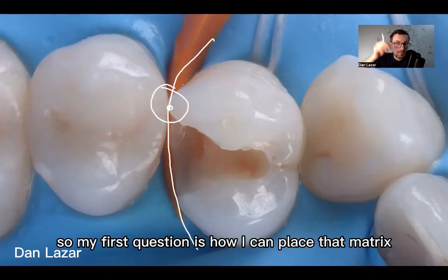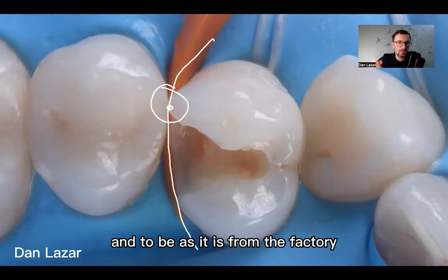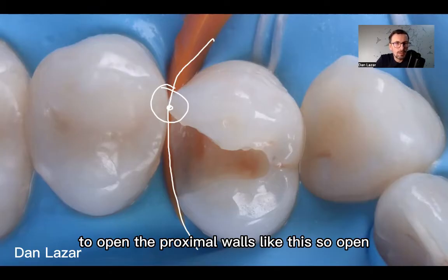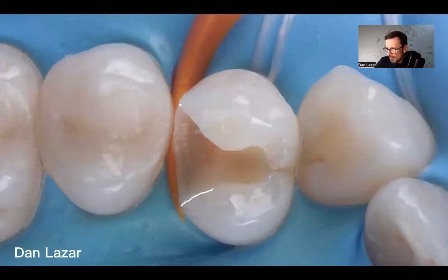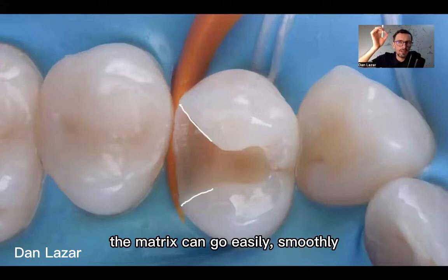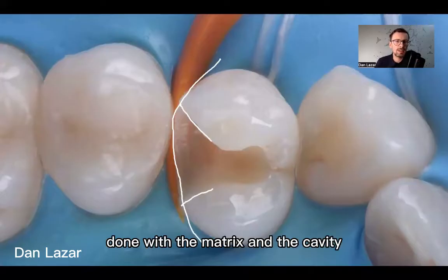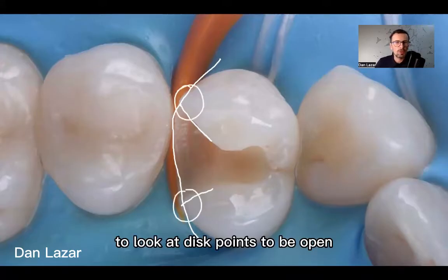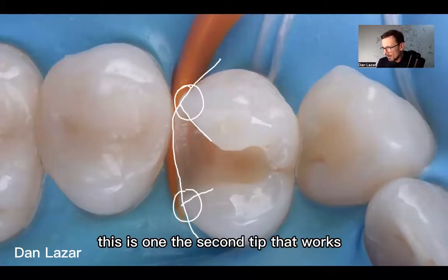My first question is how I can place that matrix in the proximal and have it remain as it is from the factory. The answer is to open the proximal walls like this — open. In this way the matrix can go in easily and smoothly, and you will have a nice contour from the matrix and the cavity. So my first tip is to look at these contact points and keep them open. In this way the matrix will stay nicer.